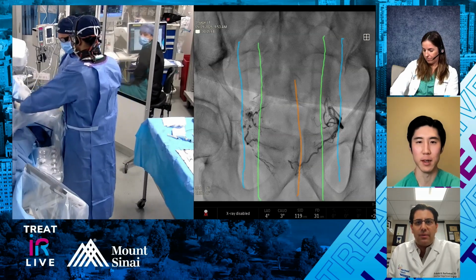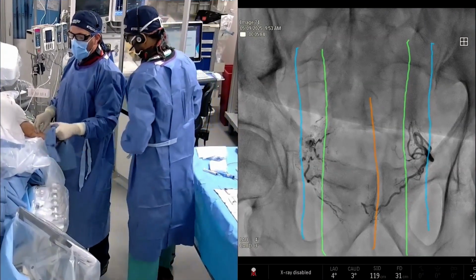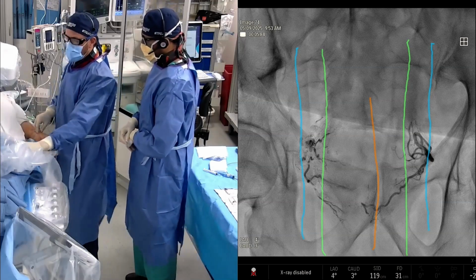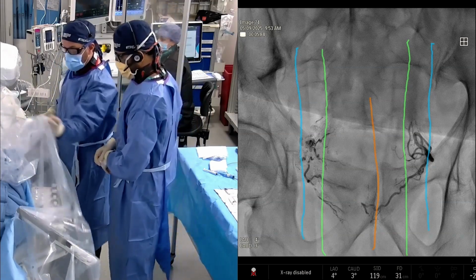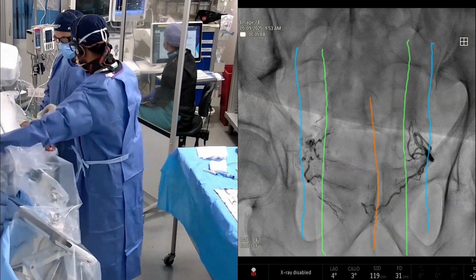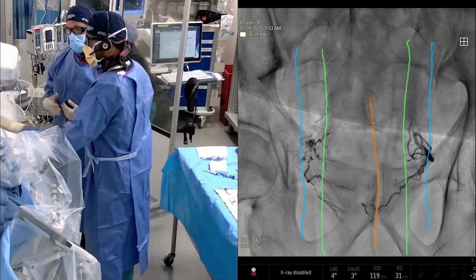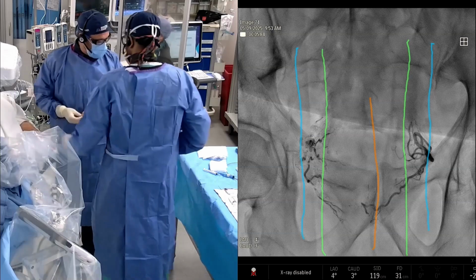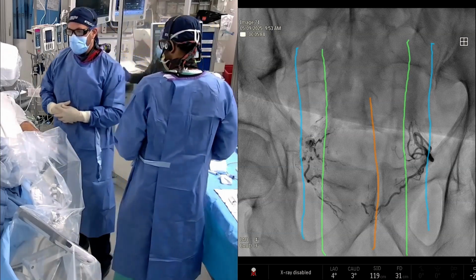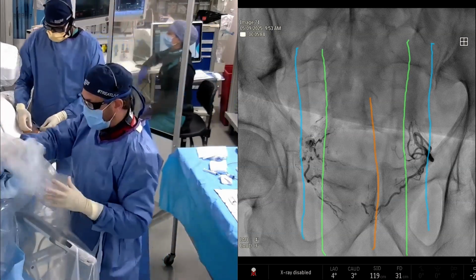Well, there's a couple of things that help out here, and I wanted to just review that before we finish. I think radial access, as you guys can see, is faster than femoral with people that know how to do radial access. There's no question about that. We've seen that in clinical studies as well. And the reason is because, with the exception of navigating through the arch up top, it's easier angle-wise to get into the internal iliac arteries. And then you don't have to do any sort of flipping.